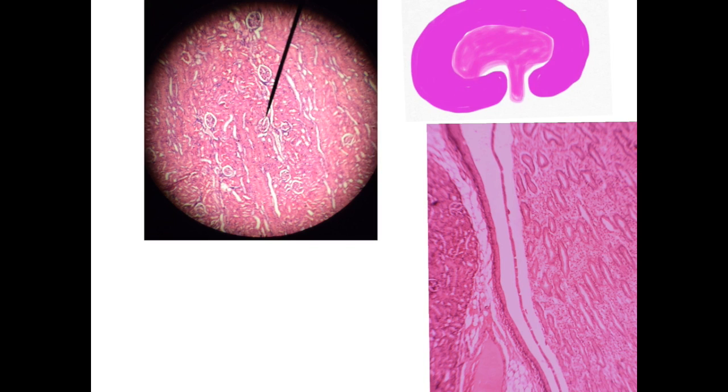These glomeruli are highly scattered in the cortex. By going deeper towards the medulla, you will notice the collecting tubules and ducts, and of course you can see the start of the calyx lined by transitional epithelium, but this is very important, and it is enough to diagnose the kidney by diagnosing the glomeruli as well as the collecting duct.